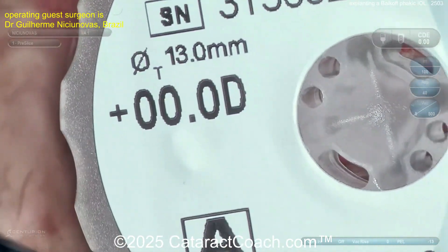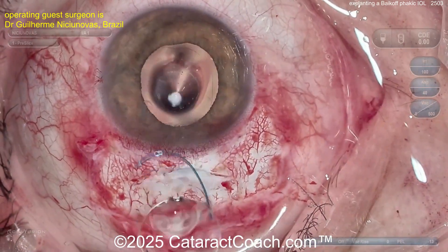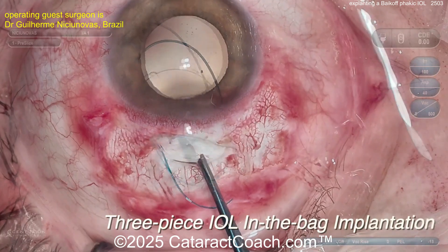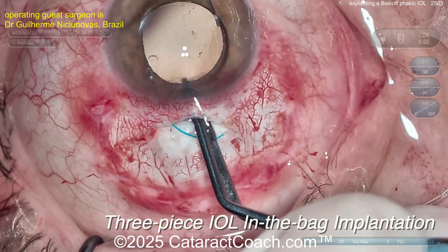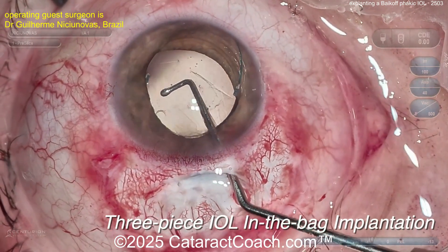Should you leave the patient aphakic? No — always put a lens in. Why? Because it's a barrier. If you don't put a lens, you'll instantly get PCO. And when you YAG the PCO, you'll get vitreous coming into the anterior chamber. Don't do it. If you have a patient who needs a zero power lens, always implant the lens — don't leave them aphakic.